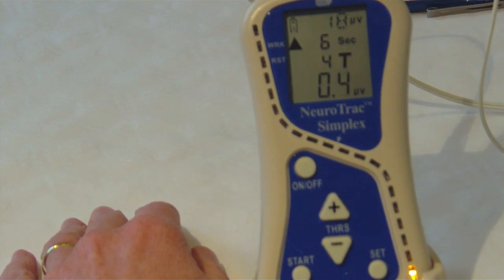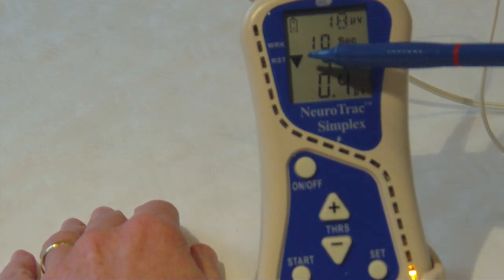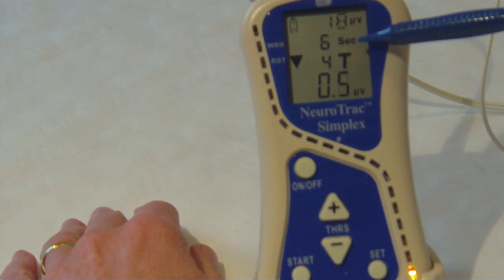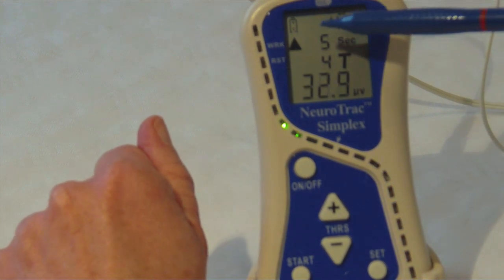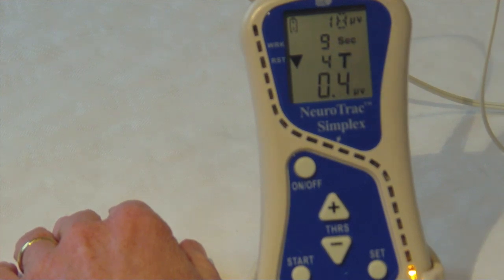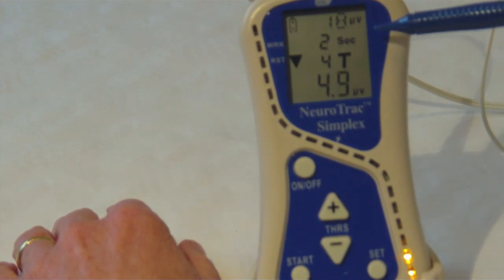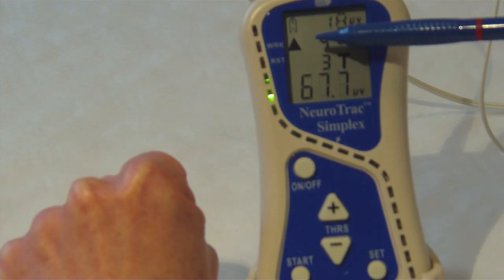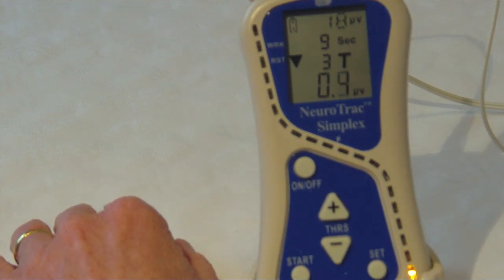Press the start button to begin. You can see the down arrow is telling me to relax my muscles and it's counting down — I'm going to do a 12 second rest phase. Then as the arrow goes up I'm going to do a six second contraction, and as the arrow drops I'm going to let the muscle completely relax again. The muscle is as relaxed as I can get it, then in the contract phase the arrow goes up and I hold on to that squeeze for six seconds. Every time I contract the muscle I'm aiming to get the bleep noise from the unit, as that's set at my threshold.